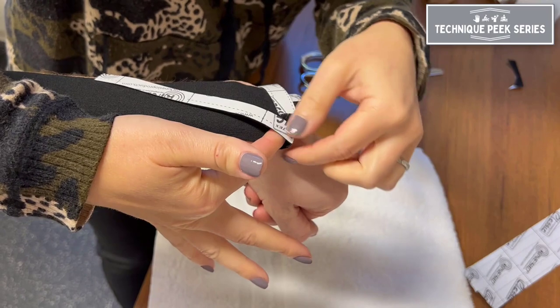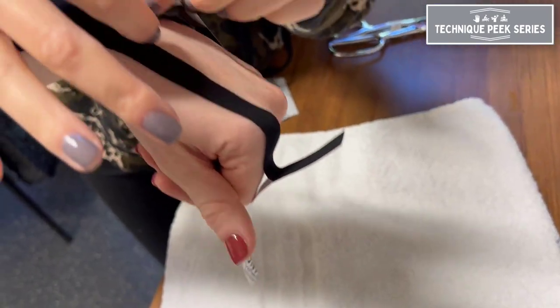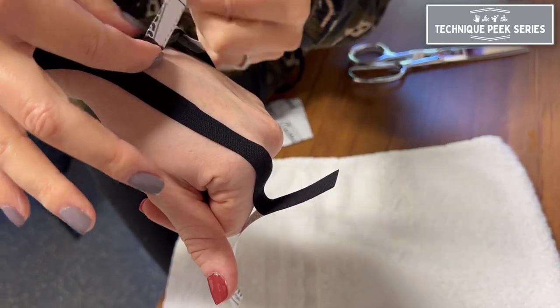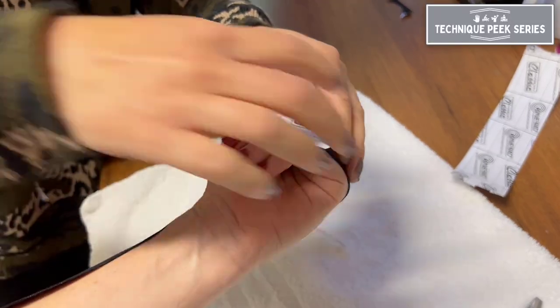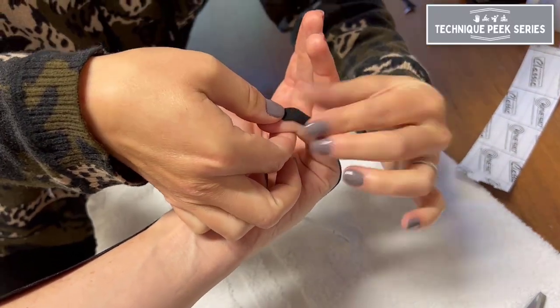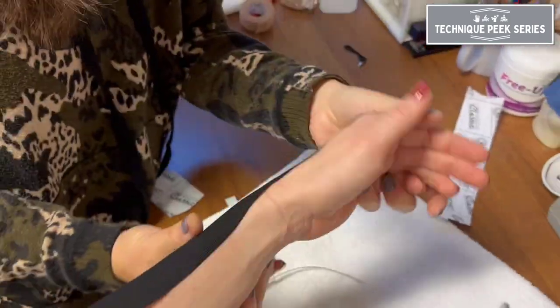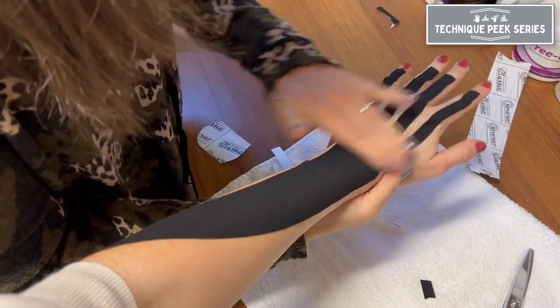Then apply each finger tail with 15 to 35 percent tension until you get to the end, where you will apply the last portion with no tension. As always, rub vigorously to activate the adhesive in the tape.